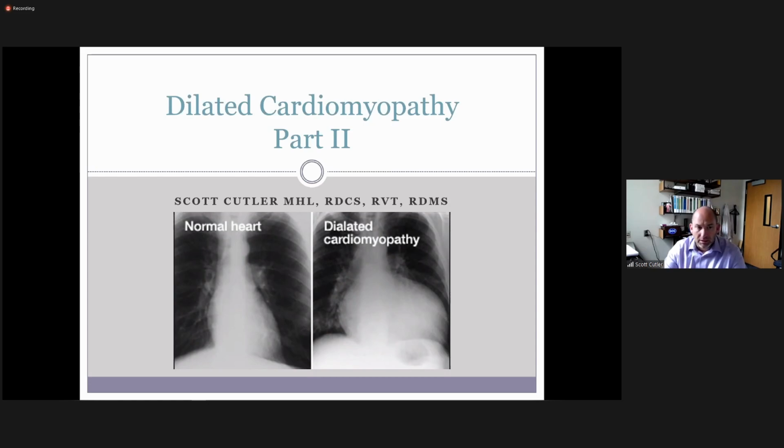But at the same time, if it's mitral stenosis, it's more likely that we're going to have a smaller LV than normal anyway. So there'd be a lot of other stuff going on if that was the case. Yeah, and it can get complicated. It really does sometimes become, what came first, the chicken or the egg.